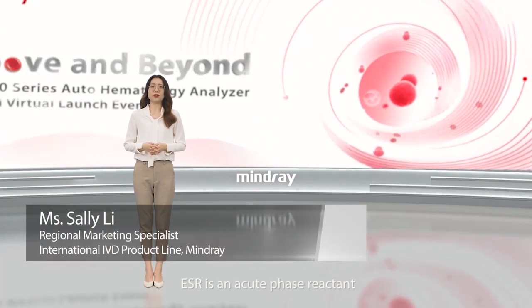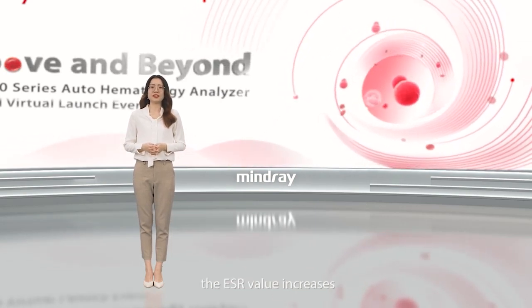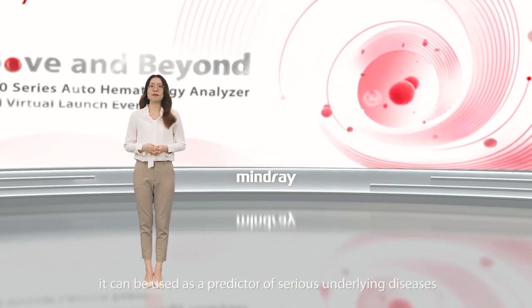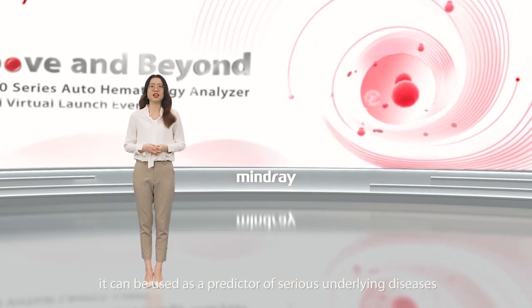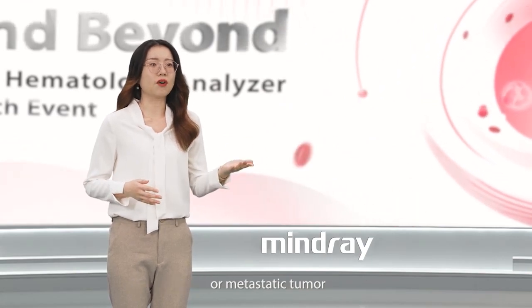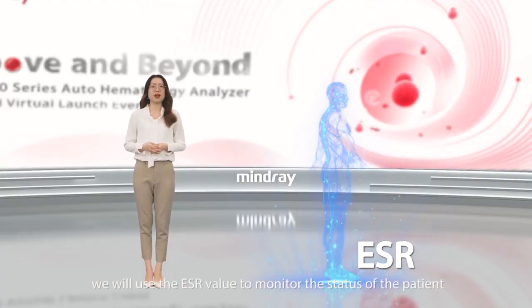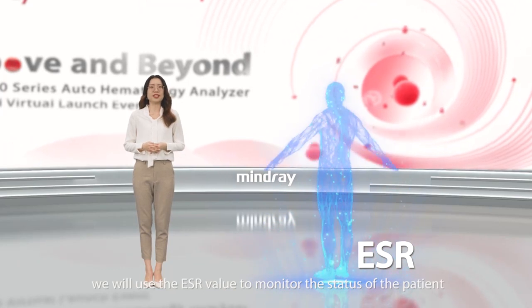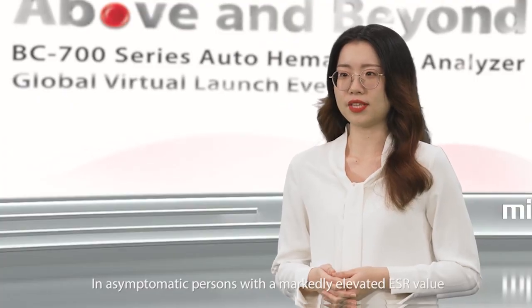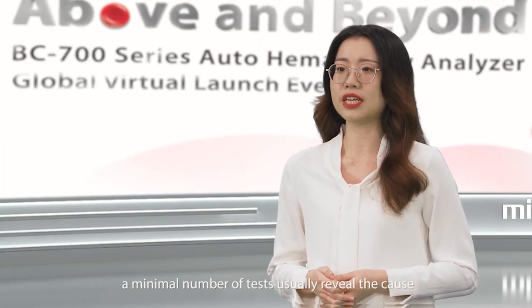ESR is an acute phase reactant, which is a marker for inflammation. When inflammation occurs, the ESR value increases. Because ESR is correlated with diseases, it can be used as a predictor of serious underlying diseases, most often infection, collagen vascular diseases, or metastatic tumor. After the diagnosis, we will use the ESR value to monitor the status of the patient, as it is correlated with response to therapy. In asymptomatic persons with a markedly elevated ESR value, a minimal number of tests usually reveal the cause.